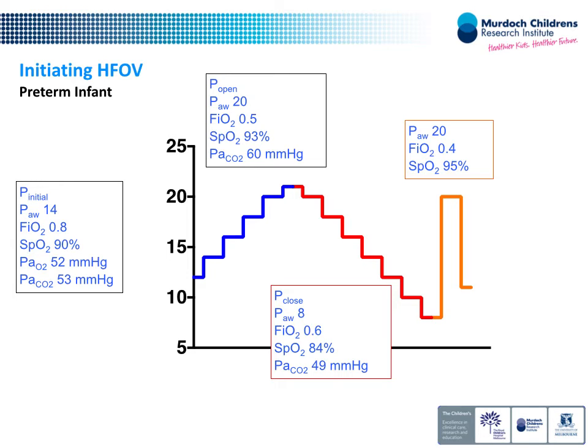There could be erosion. Well, but I guess you're doing all of this without surfactant. Yeah. Excellent. And that's the big thing, right? You said you're going to change the lung compliance if you give it. Yeah. So you have to do this all over again. Yeah, and what will happen if you give surfactant? Will the cliff move higher, or will you get more space? You'll get more space. You actually will build more space between you and the cliff. But the mean airway pressure that is right in the future is not the mean airway pressure that's always going to be right now, and vice versa. Because you will do things and the baby will do things.